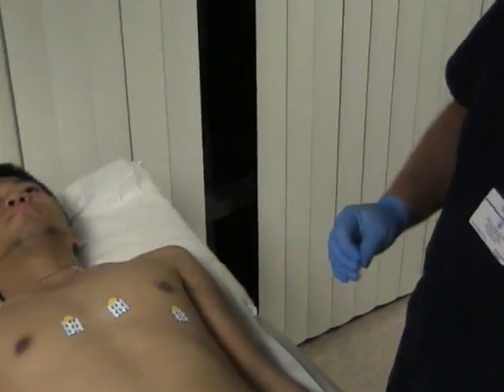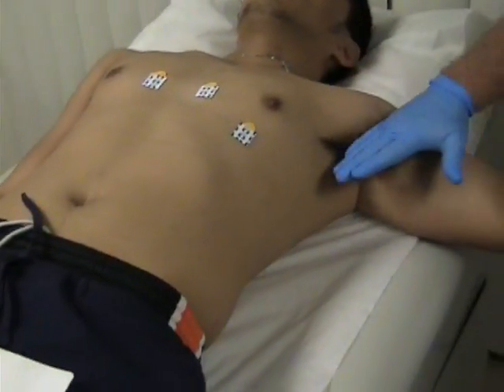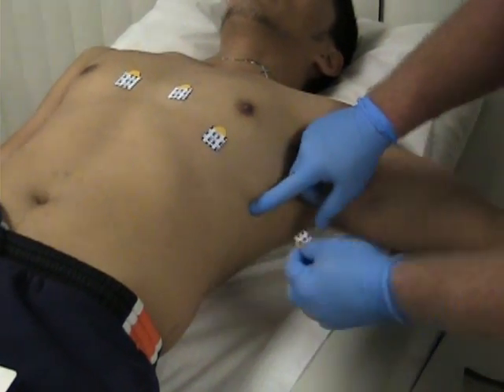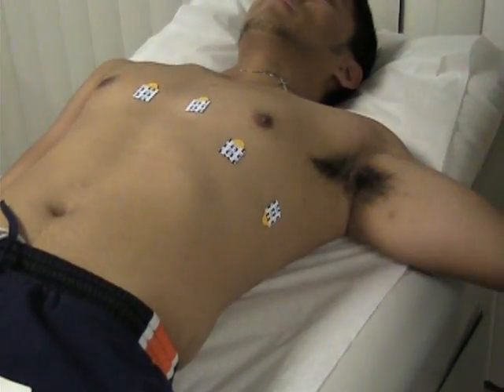The next lead will be V6. For V6, we raise the arm, find the mid-axillary line, come down to the fifth intercostal location, and place the V6 lead there.